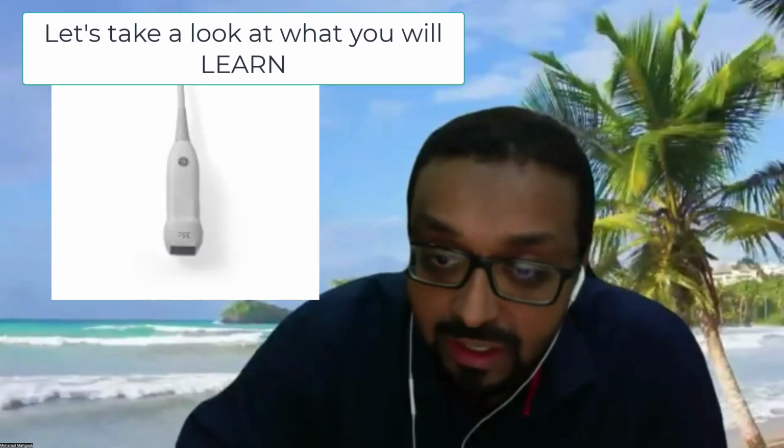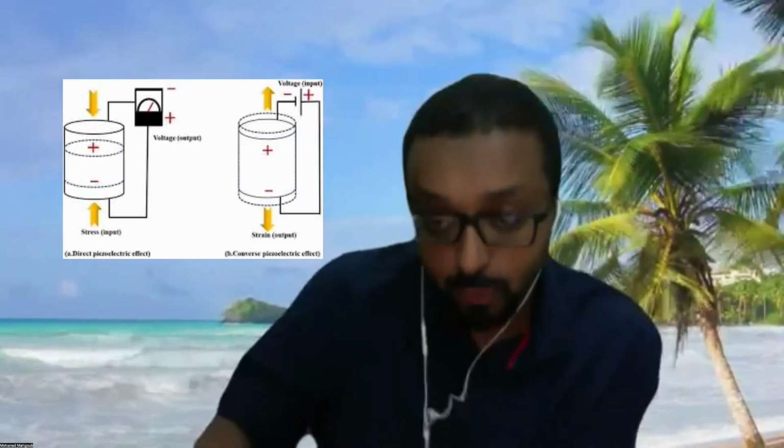So piezoelectrical crystals are inside the probe, and basically they transform the electrical energy that we put into the probe into a mechanical one.